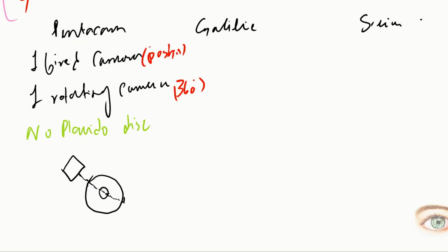Since we also do anterior segment OCT and observe the anterior segment with corneal topography, it also measures the angle and the thickness and the posterior and anterior surfaces of the cornea. Now it moves 360 degrees and takes these pictures like this, right? And a fixating camera observes the position of the eye and sees if the eye is moving or not.